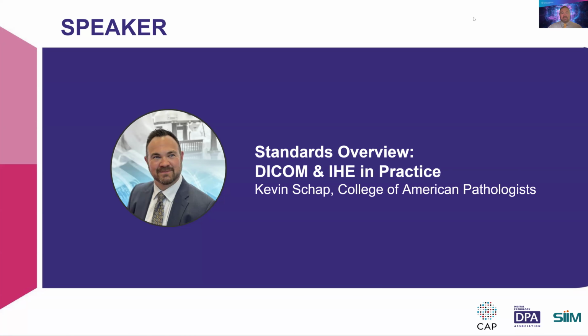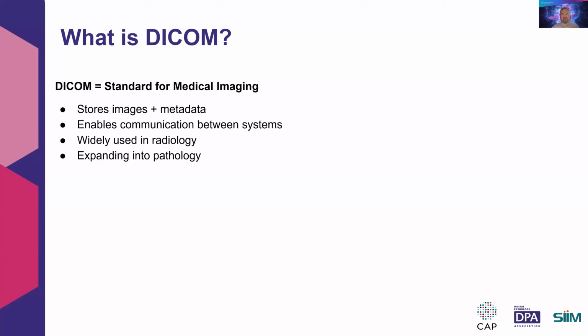So today I'm going to talk about DICOM for pathology, what it is, why it matters, and why you may hear people talking about it as digital pathology continues to scale. I'll aim to keep this approachable, but fair warning, DICOM can get technical pretty quickly, and that's partly the point. So, what is DICOM? DICOM stands for Digital Imaging and Communications in Medicine. At its core, it's a standard, a very detailed set of rules for how medical images are stored, described, transmitted, and understood across systems. As we heard, radiology has been using DICOM for decades across multiple kinds of modalities.